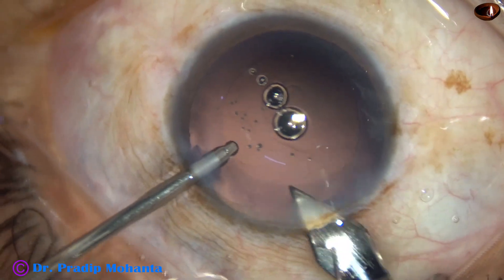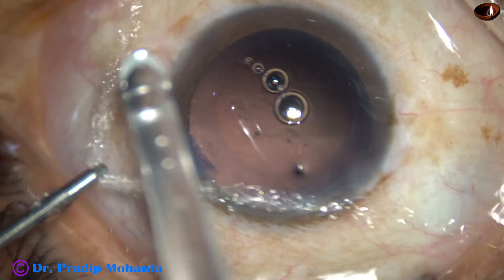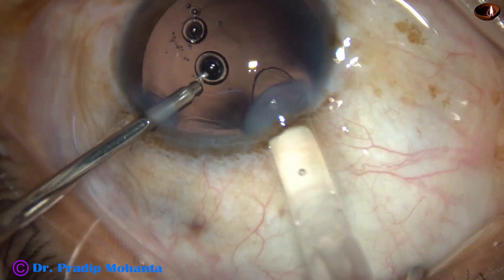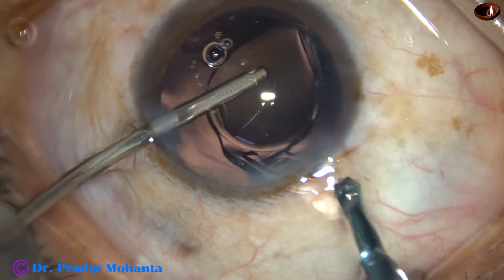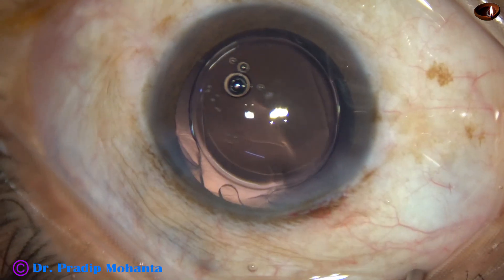I am using a B cartridge, so I enlarged the main wound. The size of the wound is about 3 mm now. The lens goes in and just by a push of the left hand instrument, it goes into the back.